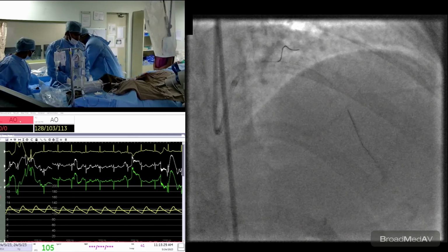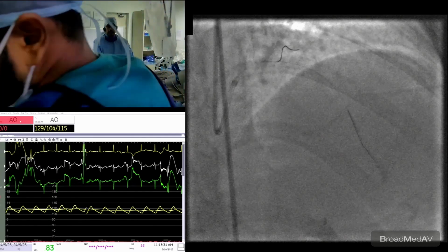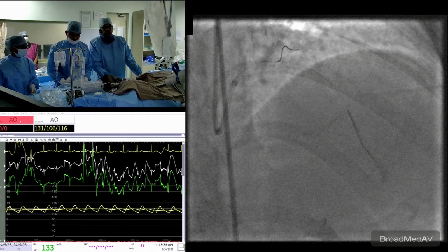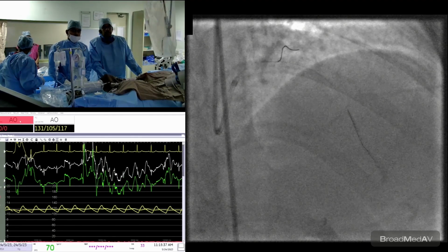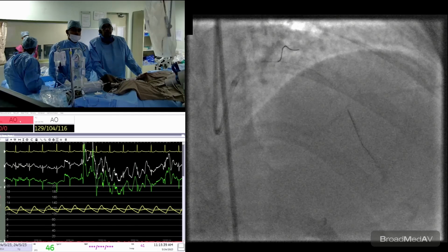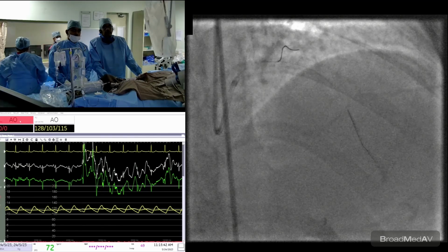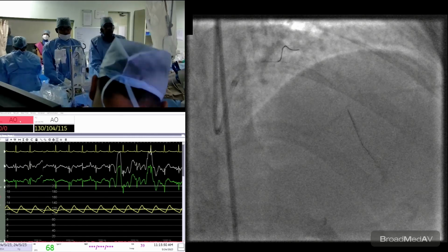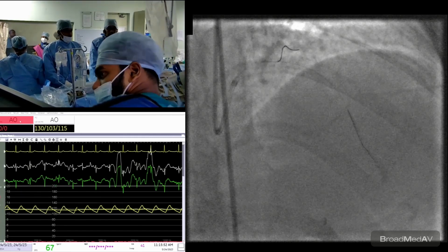Okay, so we have a slight disruption on the machine. Otherwise, I've removed the catheter out and we're going to take another picture after it boots in again. No, I think that the wires might get disturbed. What is the username password?